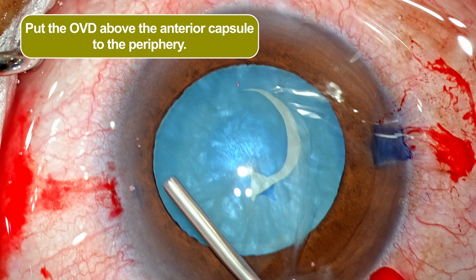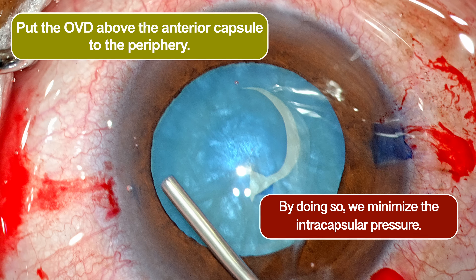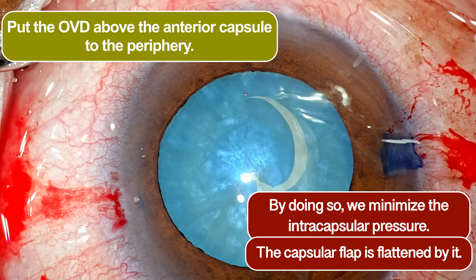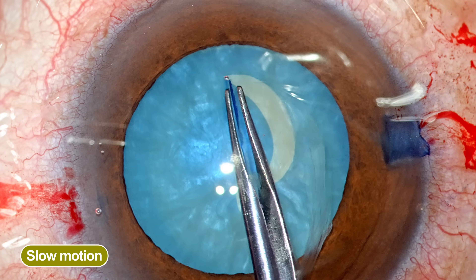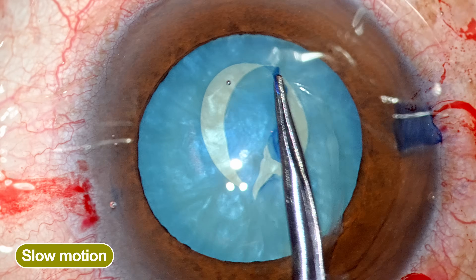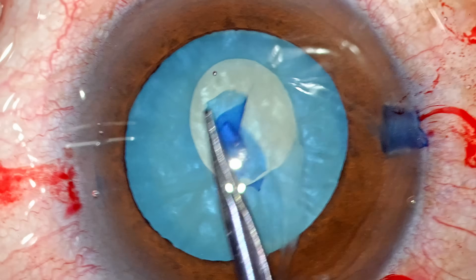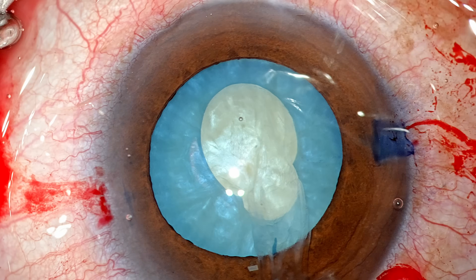I am consciously placing the OVD in the periphery, almost near the angle. This ensures the OVD does not enter the capsule bag opening — which would again increase the intracapsular pressure — and it also flattens the capsule flap. The strategy is not to fold the capsule. Typically we fold the capsule and tear; in this case we keep it flat and pull it centripetally. This results in a tear that is slightly uncontrolled, but rest assured it is unlikely to run towards the equator — it is always being pulled towards the center. There was also a small notch which I took care of before decompressing the bag.